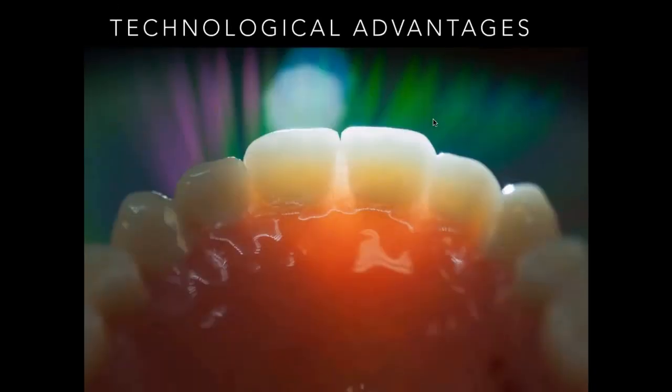So lastly, after 2 years of making digital dentures, there are some significant technological advantages that I did not even realize were there when I started. First of all, this is an example of a monolithic denture with the traditional IPN Lucitone resin IPN teeth, where these teeth are part of the denture base. They act totally differently than bonded teeth put in a milled base, and the advantages are incredible. This is an animation.